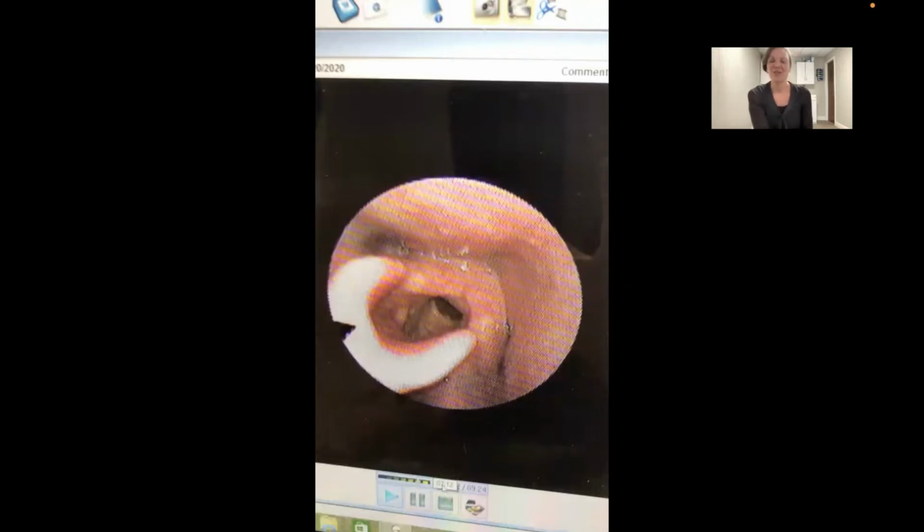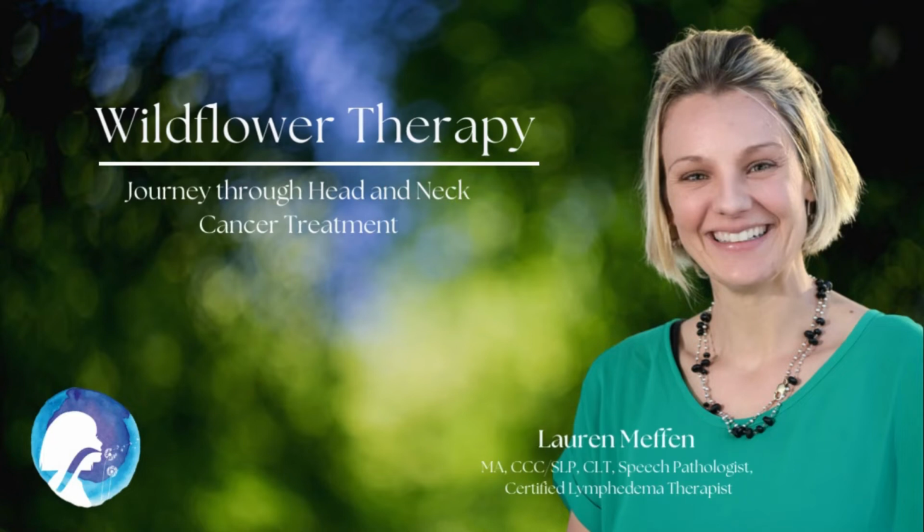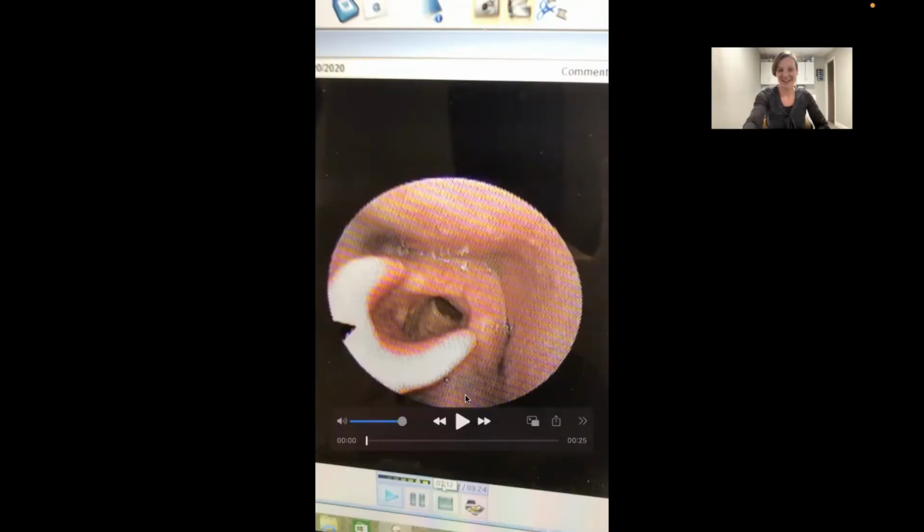Today we are going to review a fiberoptic swallowing study, a clip of the swallowing study, and discuss the movement of the epiglottis. Okay, let's get to it. So I'm going to start off by playing our fiberoptic swallowing study.